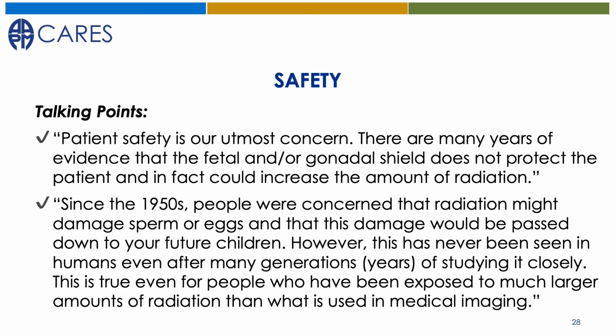In most situations, it is appropriate for the radiographer and/or the physician to explain why shielding is not recommended. If the patient or parent continues to insist that shielding be used, shields may be used at the discretion of the radiographer, provided that careful attention is given to ensuring that image quality is not compromised and overall dose is not increased. While we propose some general rules for discontinuing the use of gonadal or fetal shielding during pelvic and abdominal radiography, it is important to recognize that there will be situations that require professional judgment based on the individual patient and circumstances.